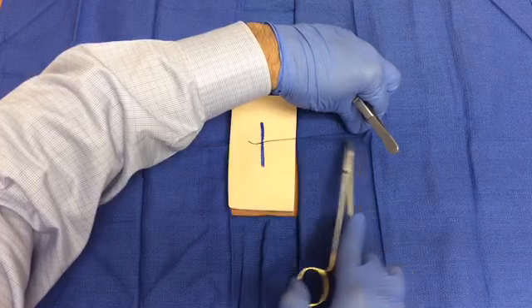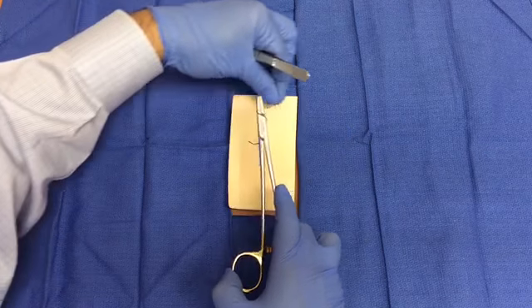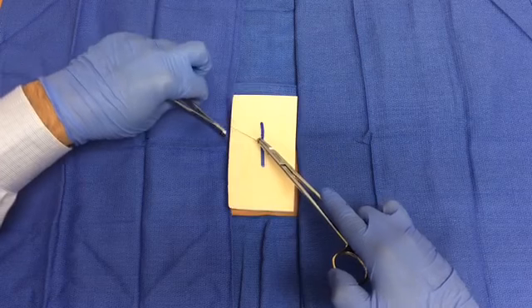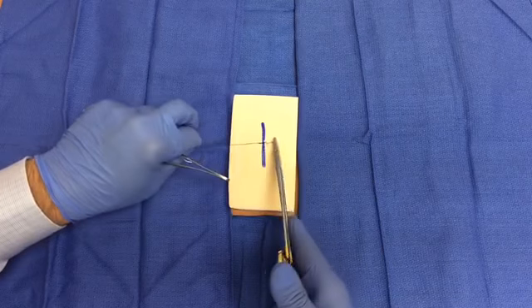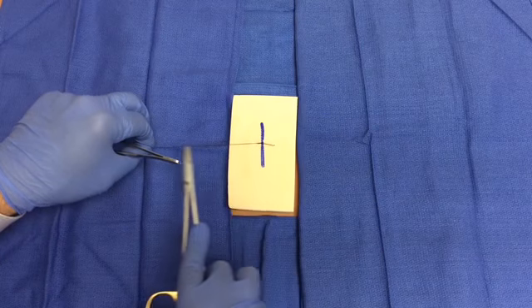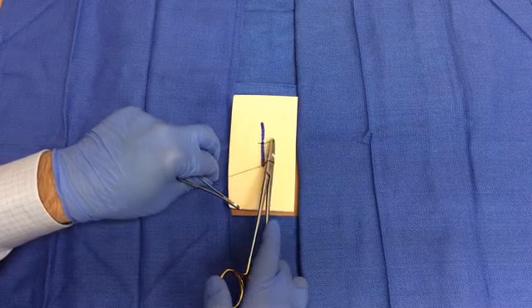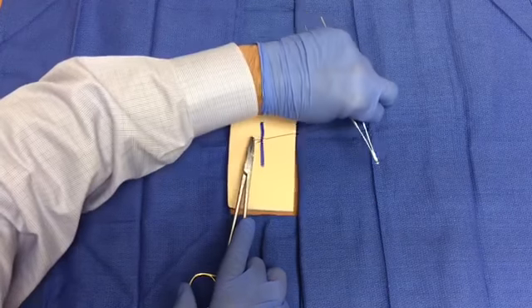Hold your needle driver in the middle of the two strands. Lift the long strand up over and around the instrument to create one loop for the second throw. Open your needle driver and grab the distal aspect of the short suture tail. Pull it through the loop and lay it down in the opposite direction to the first throw. For the third throw, again place your instrument in the middle of the wound. Lift the long strand up over and around the instrument to create one loop. Open your needle driver and grab the distal aspect of the short suture tail.